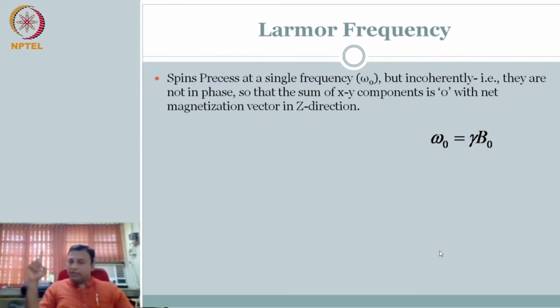Now I am saying, okay, you are all the same nuclei, hydrogen, so you are all doing the same frequency, right? You are all spinning at the same speed, angular velocity. But now I say stop. That is, I switch off the external magnetic field, or in some sense I say stop. What happens instantaneously?